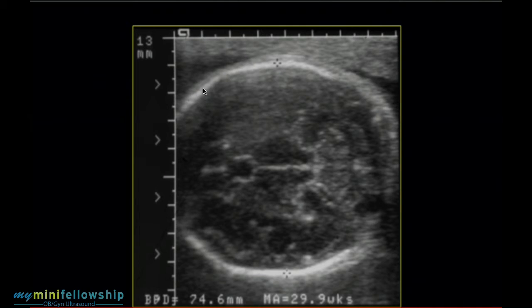You do that by looking at the calvaria. You want the calvaria to be perfectly symmetrical. So we have symmetrical calvaria telling us that the beam is not inclined, and we have the 3rd ventricle flanked by the thalami. So we have the correct plane of section.